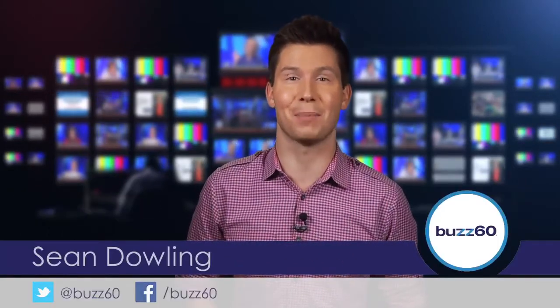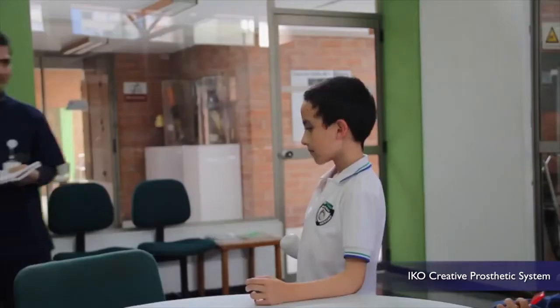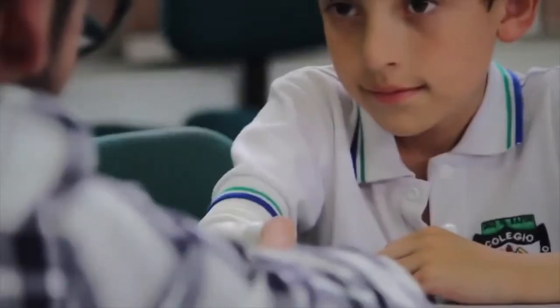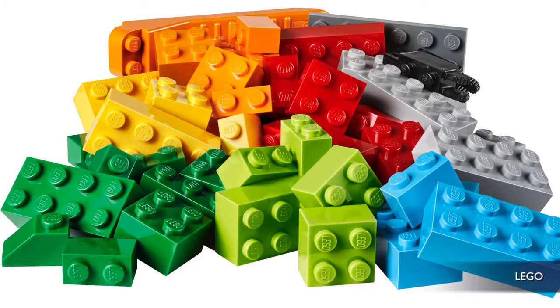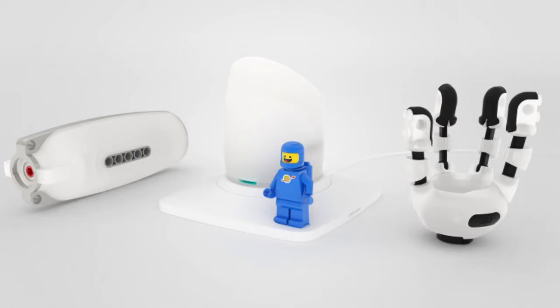Hey everyone, I'm Sean Dowling for Buzz60. Colombian designer Carlos Arturo Torres wanted child amputees to forget about the social and psychological challenges sometimes associated with missing limbs, and instead get kids to have fun with their prosthetics.